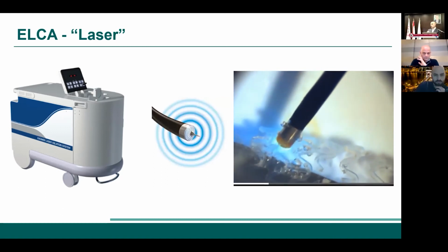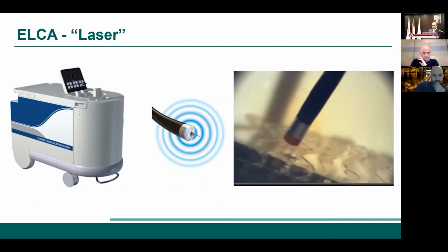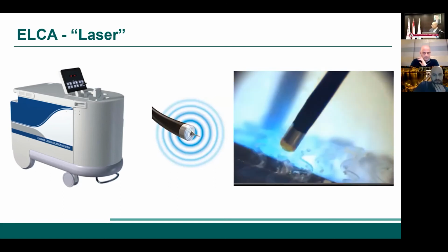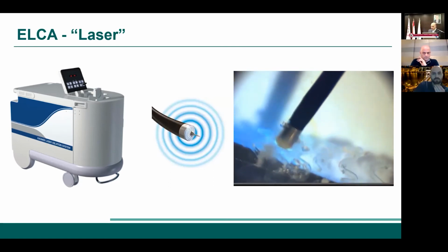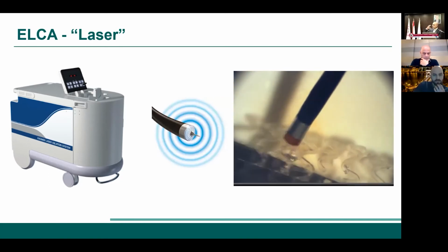Of course, you're anticoagulated. That's why in peripheral intervention you can do anything, such as below-the-knee critical limb ischemia, but when you're doing it in the coronary, it has to really be justified. Before the invention of shockwave, I think the biggest excitement for this was probably when you have in-stent restenosis and calcium caused by an underexpanded stent with calcium behind it.